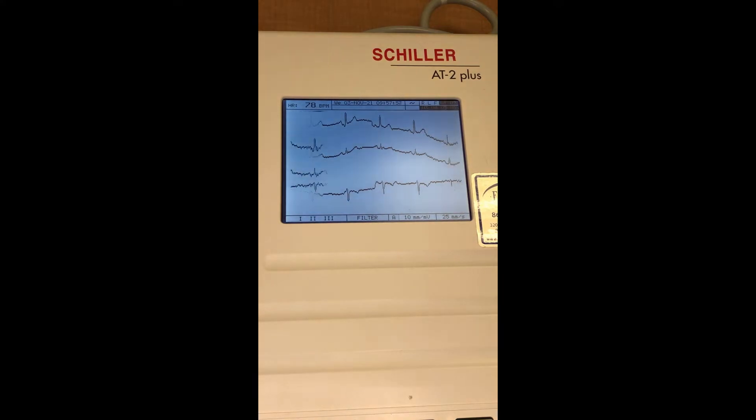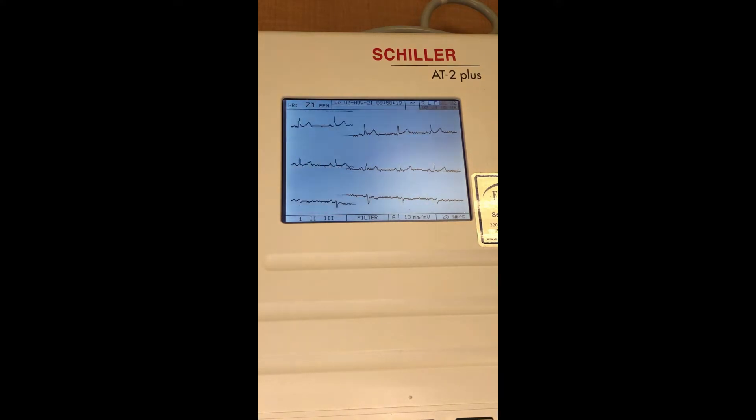Notice what happens if I start to move my upper limbs — you can see how the waves just go crazy. The reason is it's now picking up electric signals created by the skeletal muscles in my upper limbs and by my heart at the same time. So whenever you're hooked up to one of these ECGs, you want to make sure you're sitting nice and still, with hands resting at about abdomen level, so the only electric signals being created are by your cardiac cells.